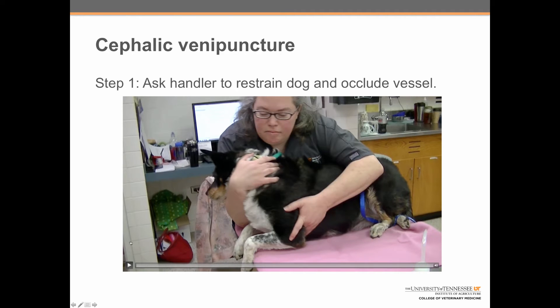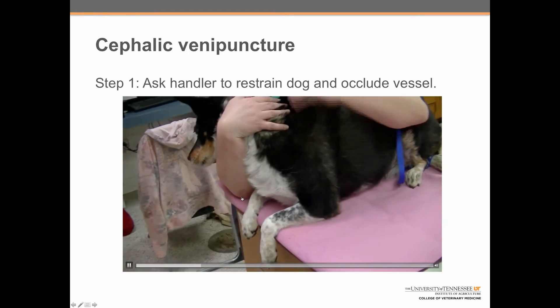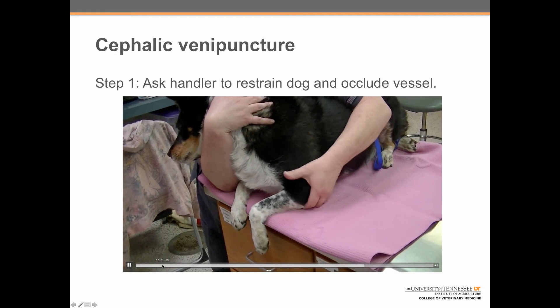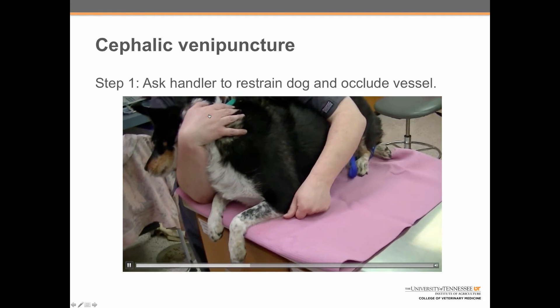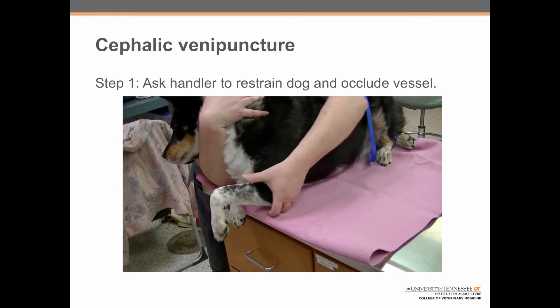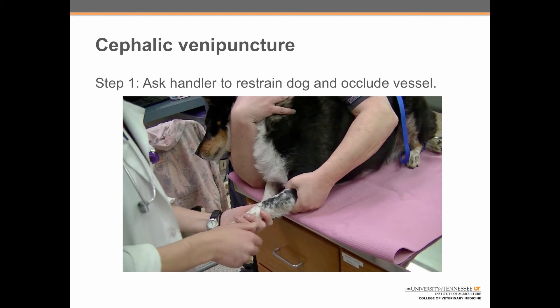Step one: ask the handler to restrain the dog and occlude the vessel. Here we can see Abby restraining this dog. She's got her arm across the dog's neck, much like a dog in lateral recumbency, to keep the head from flipping around. Her chin is close to the dog's head so that if the dog throws its head upward, it won't whack her in the chin. She then uses the bottom of her other hand to extend the elbow and takes her thumb across the crook of the elbow to occlude the vessel.